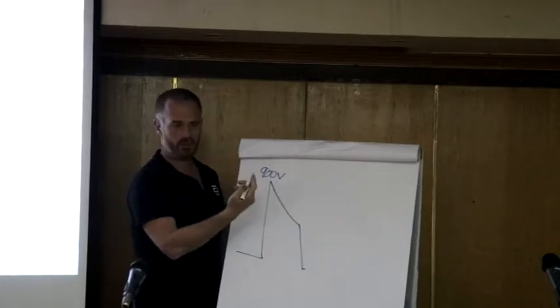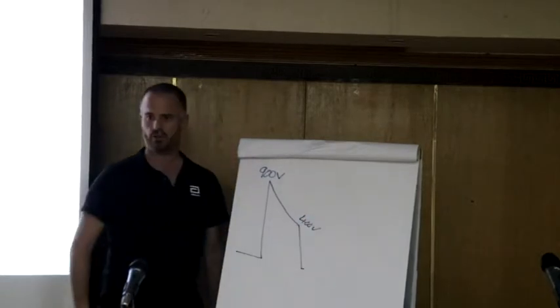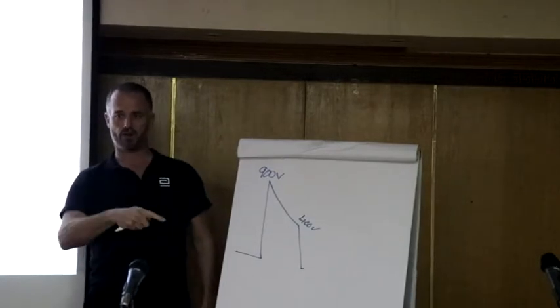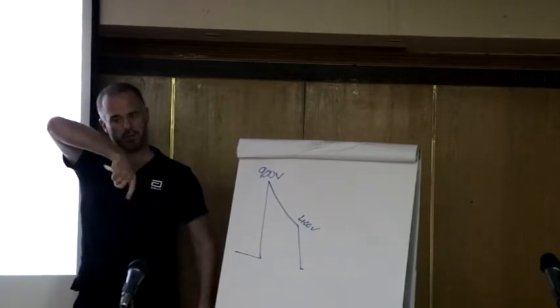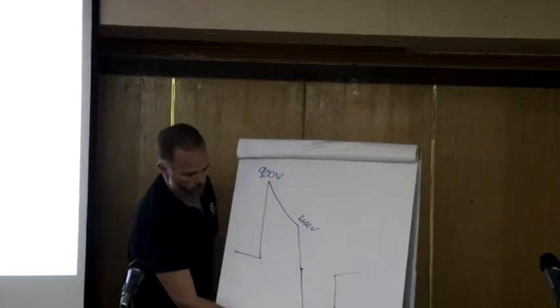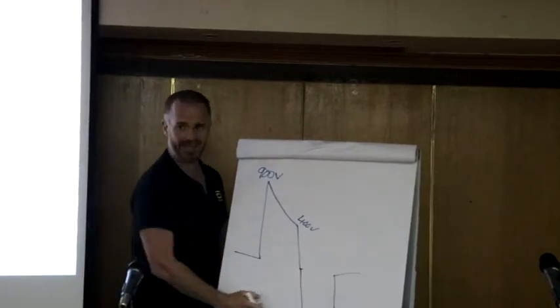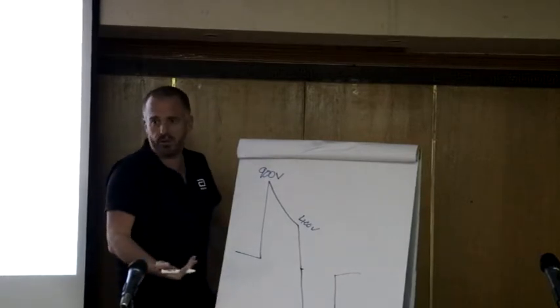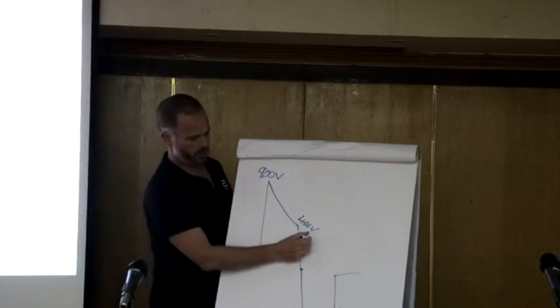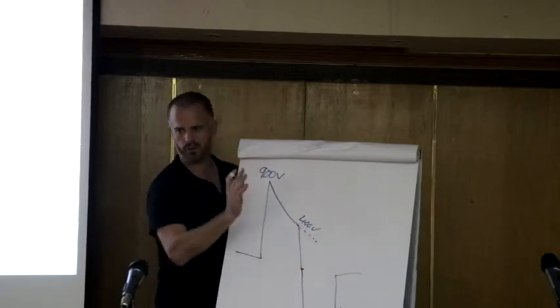It switches. So if we go with a 50% tilt to keep the numbers easy, that would be 400 volts. So it's going that way until the capacitors get to 400 volts, and then it turns around. The second phase starts at 400 volts, because that's what's left on the capacitors, and then it will bleed the capacitors down to this 50% tilt again. That's 200, right? A 65% tilt will be down to like 325. So it will keep going until it gets to 325, or 65% of this number.